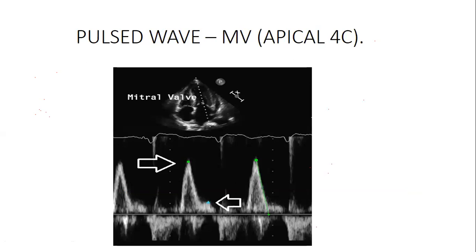Pulsed wave on apical 4 chamber, I was also just trying to demonstrate. This is the positive shift, and here, this is now the baseline, showing you the negative shift down here. This is very important when we come to talk about regurgitation and everything.